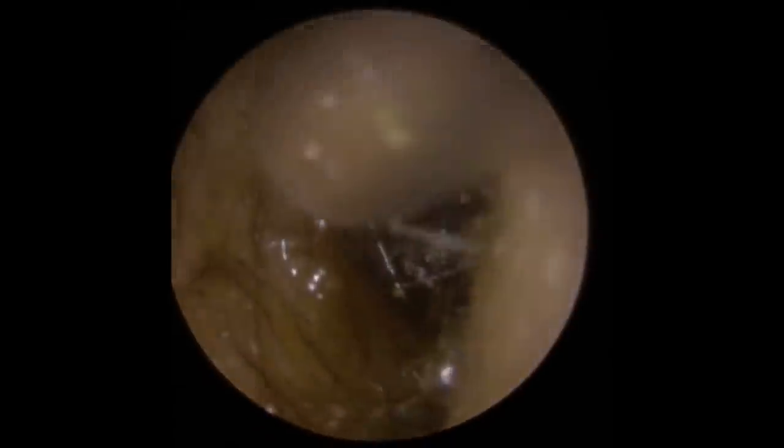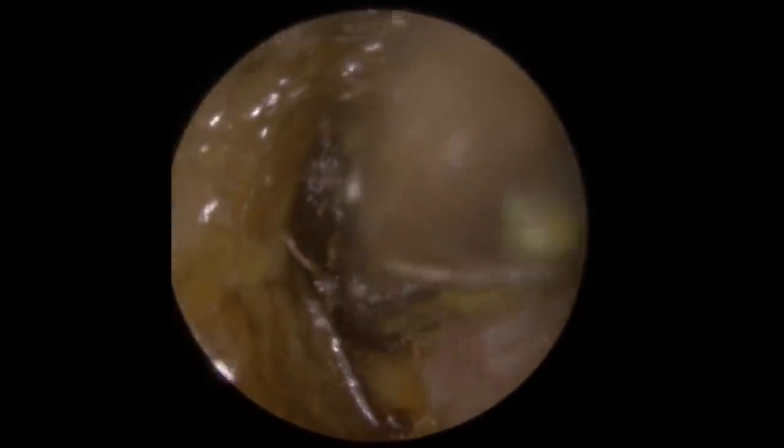That kind of sheen you can see on the wax is normally an indication that the wax itself is quite soft, or that a little bit of oil has been used in there. In this case you can see there are softer edges to the wax but more of a harder core to it, so it does look more like the olive oil rather than softness to the wax. Just peeling away from the canal wall on the edges as we always do, just trying to get a grip on the central section. Trying to hold the suction tube in place to get a good firm suction grip on that piece of wax.